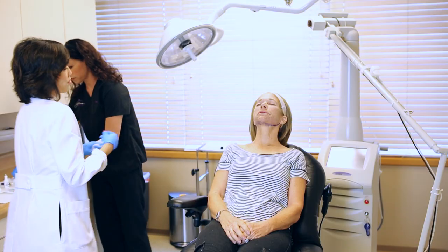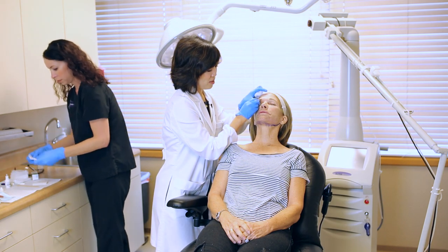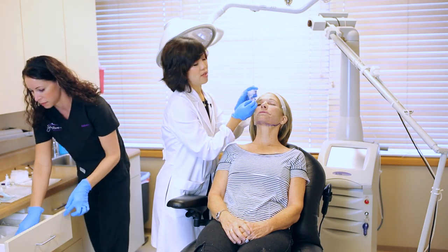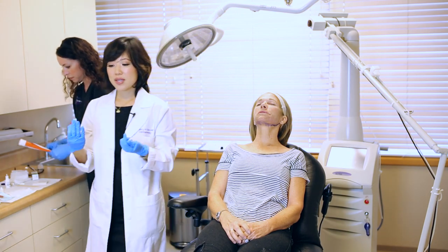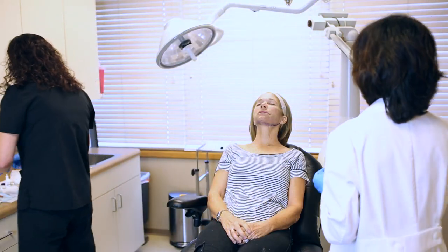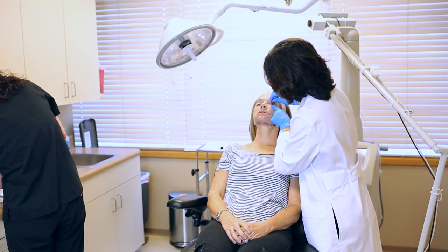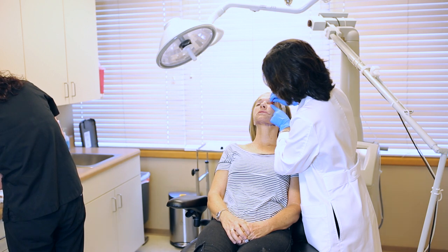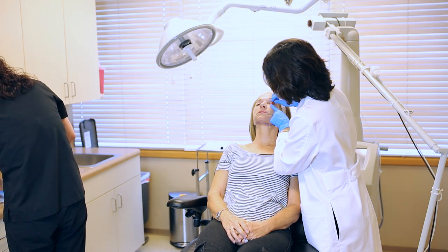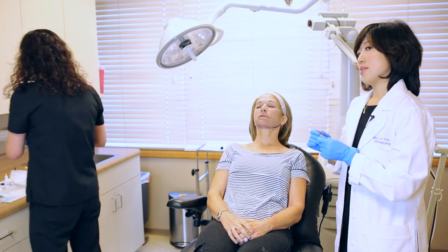The way that we care for this after a laser treatment is that we really want to keep the skin very, very moist — that's how it heals better. Keep a layer of Vaseline or Aquaphor on it pretty much at all times for the next week. In between, she's going to be cleaning it daily with gentle soapy water a couple times a day and then moisturizing a lot.